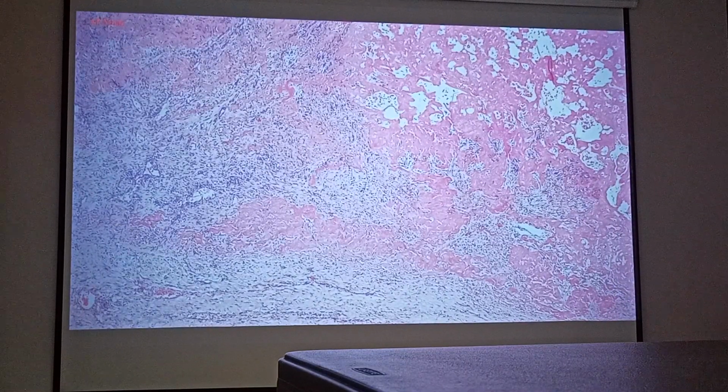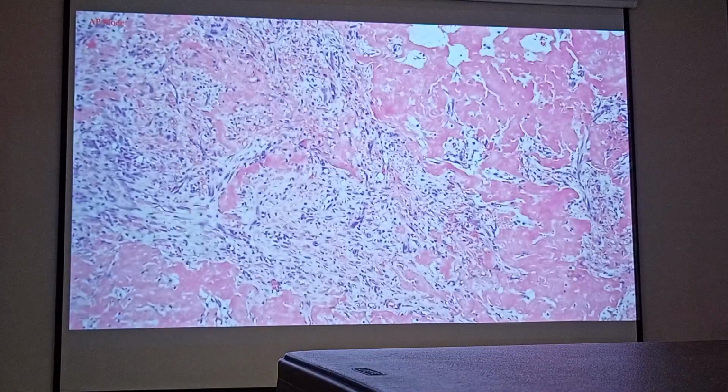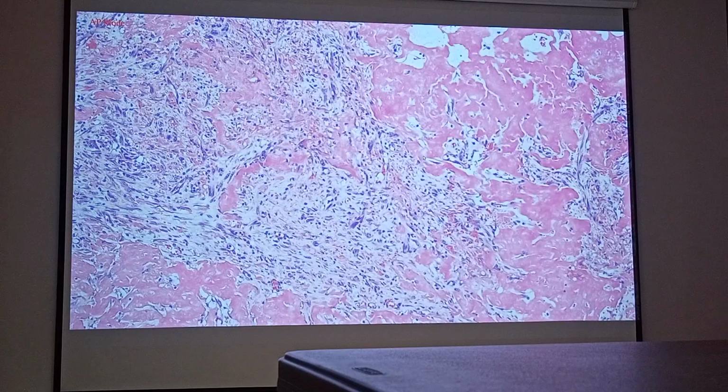Again, you can only come up with a diagnosis of an acute inflammation if you will be able to see neutrophils infiltrating the tissues of an organ. So those are the neutrophils. They are easily identified because of their characteristic polymorphonuclear appearance. Again, they are supposed to be present in the blood only. So here, we are looking at the neutrophils infiltrating the connective tissues.